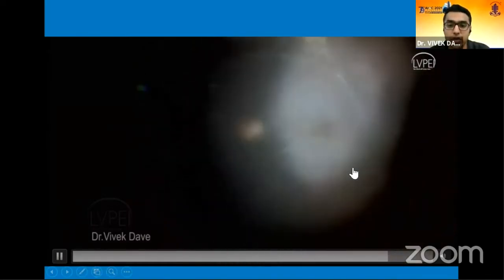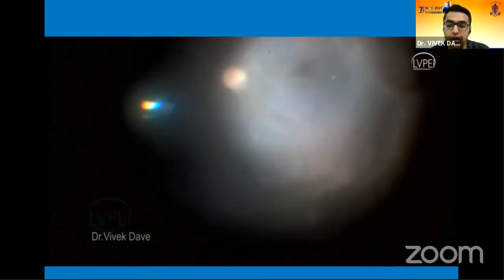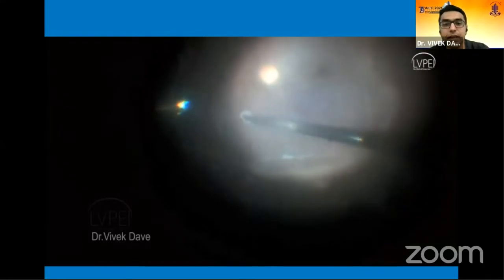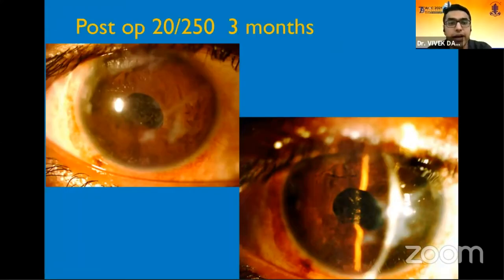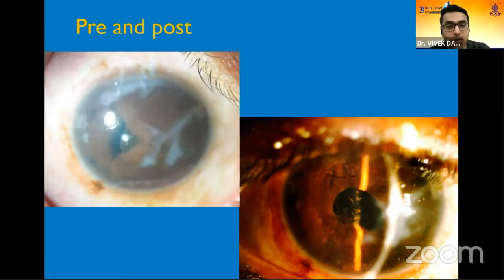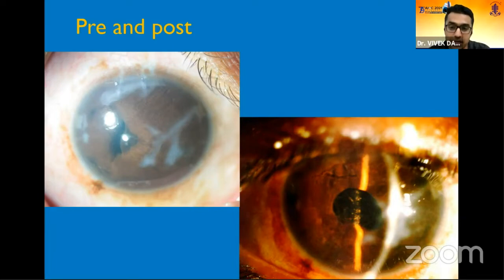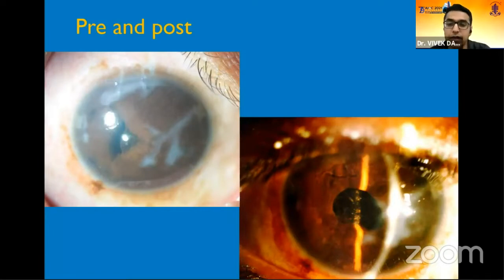The retina had a shallow retinal detachment which was also taken care of in the same sitting. Post-operatively, vision improved from counting fingers to 20/250 at three months. The post-treatment photograph shows how the anterior chamber was shallowed at presentation versus how nicely the iris has regained its contour with a nice deep anterior chamber and a pristinely clean cornea at three months follow-up.